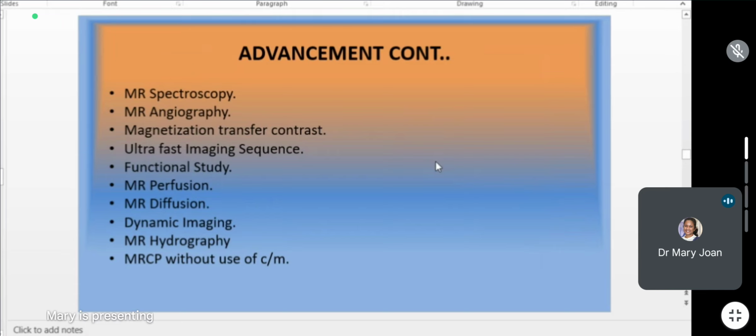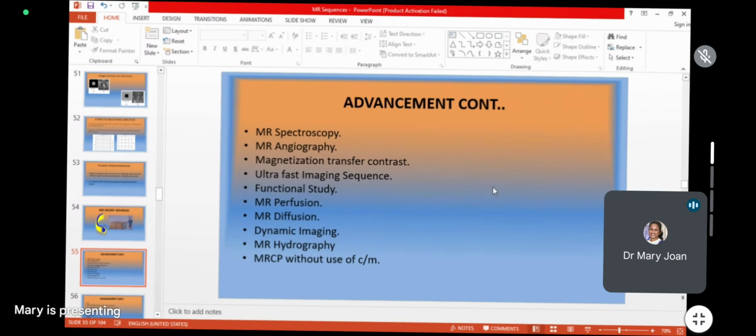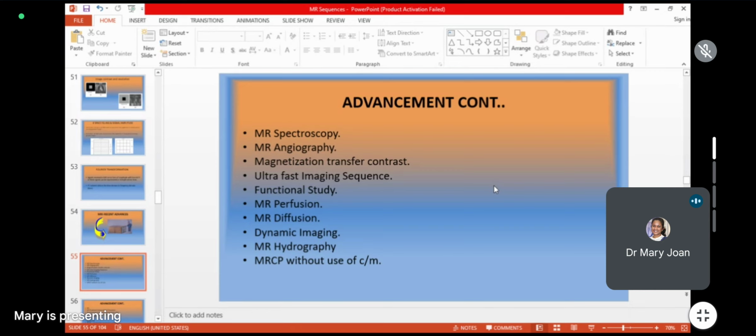We have to enhance some contrast, reduce some other contrast, and see between two things where the differences are low, in order to achieve the information we need. There is a fixed pattern when the body is under the influence of the external applied magnetic field.